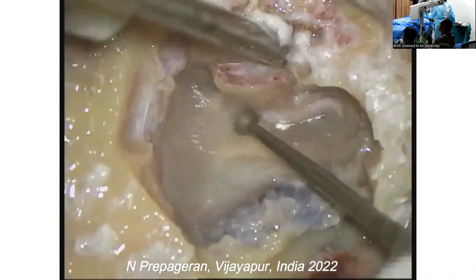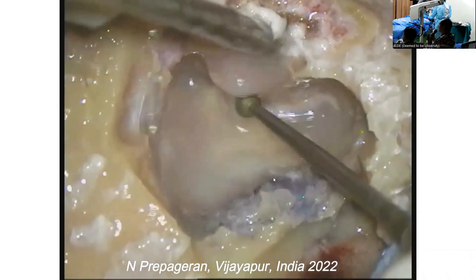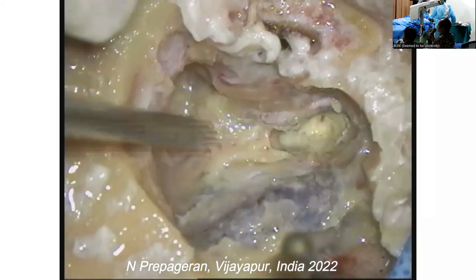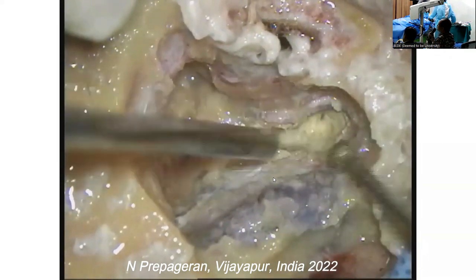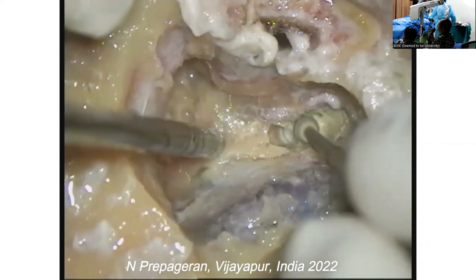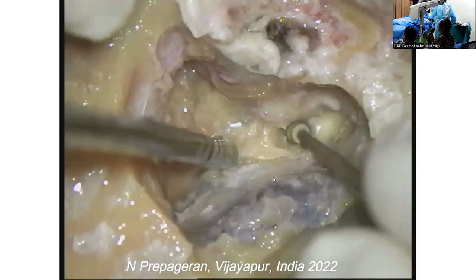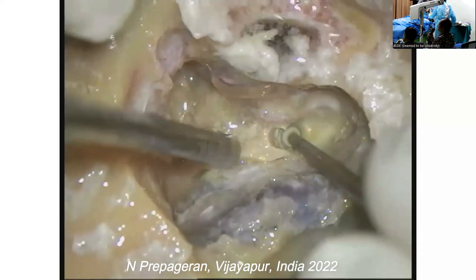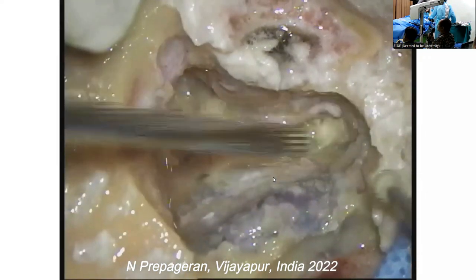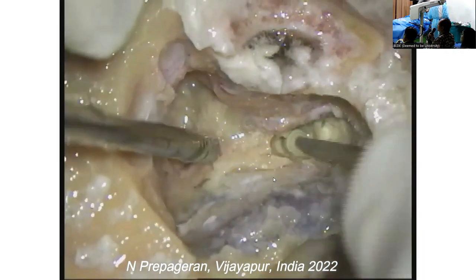This is the maximum speed, guys, 20,000 RPM. We are with you, sir. Okay, can you see, guys, now? Let's face the nerve down, and just juggle about down here. This is the blue here. Yes, let's juggle about that.